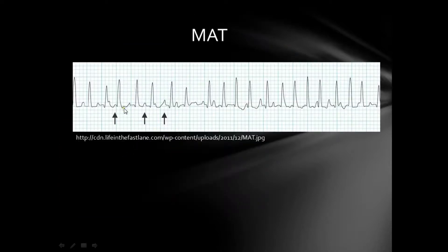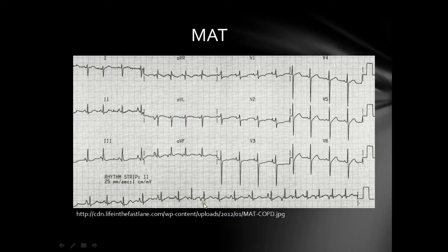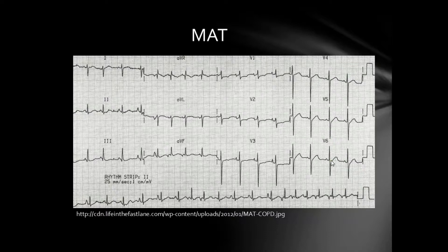This is a typical example of multifocal atrial tachycardia. First, it's an irregularly irregular rhythm with changeable RR intervals. Second, it's a narrow complex tachycardia. Third, there are multiple P wave morphologies preceding each QRS complex. Here's another example of MAT where you can see the different P wave morphologies in lead two, along with signs of right ventricular hypertrophy: the R wave is longer than the S wave in V1 and there are deep S waves in V6 — probably due to cor pulmonale in the setting of severe COPD.